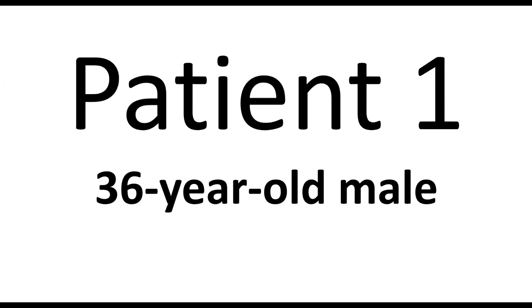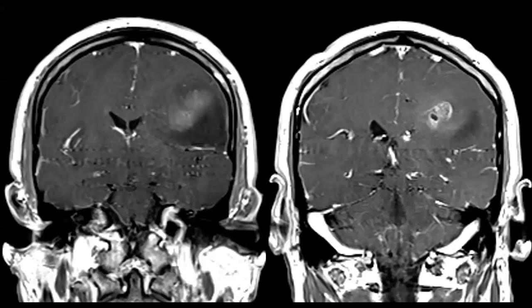Okay, let's go. Patient number one. All right, I'm gonna give you some data, and then I want a diagnosis. Okay, here's the imaging. Octavio, was that you earlier that described, or Dr. Singh? Yeah, go ahead. Tell us what you're seeing. So I see a left parietal, I believe left parietal or frontoparietal mass, which has basically at least two or three components.